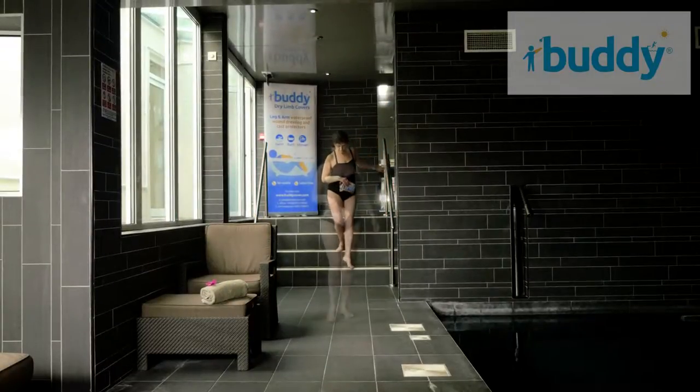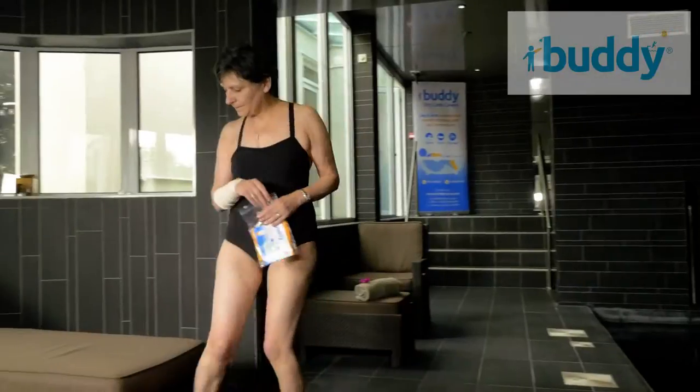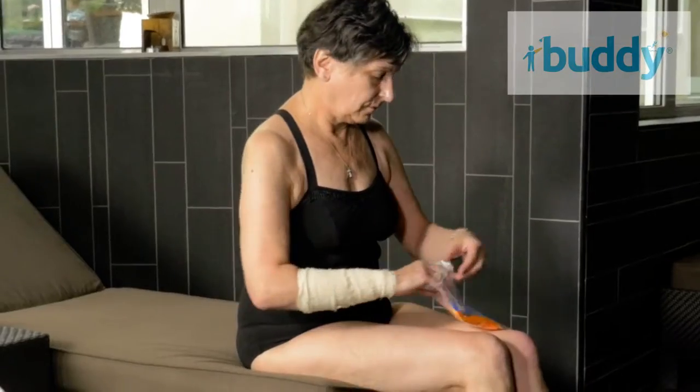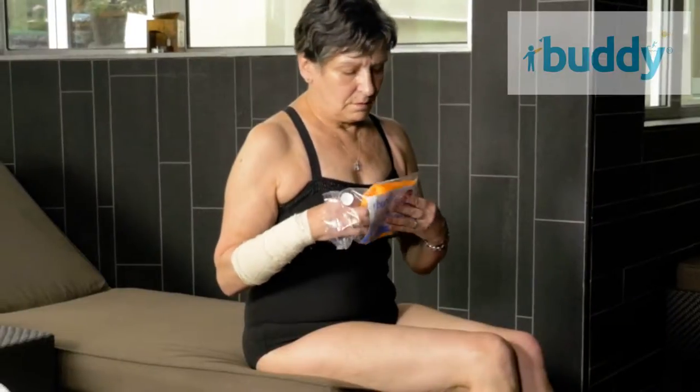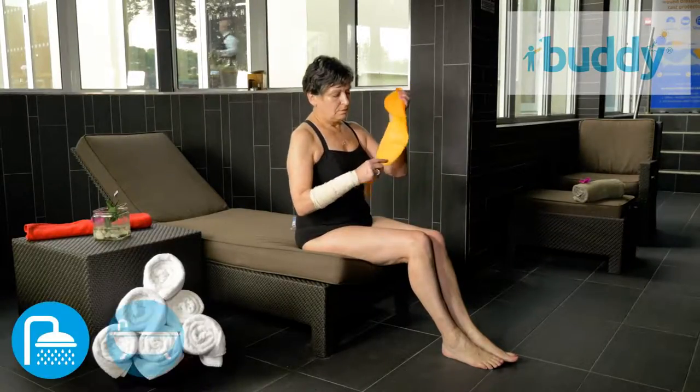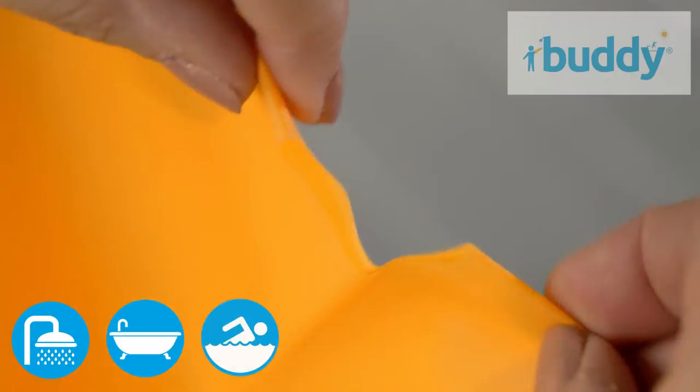Manufactured in the UK by QOL Limited, standing for Quality of Life, Buddy watertight reusable covers are designed to keep bandages and plaster casts dry and allow you to shower or bathe in privacy and even swim.